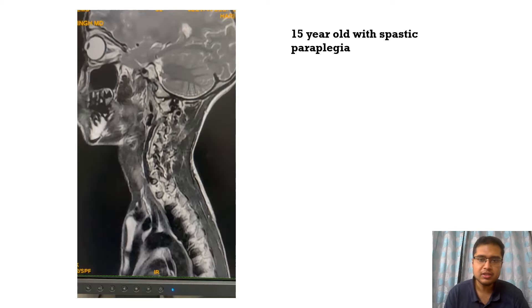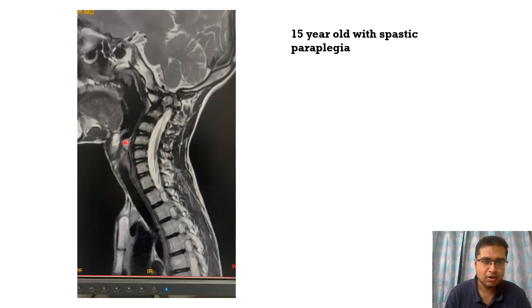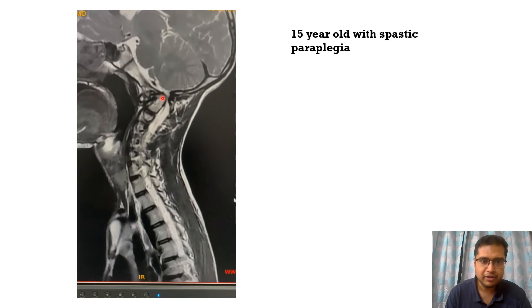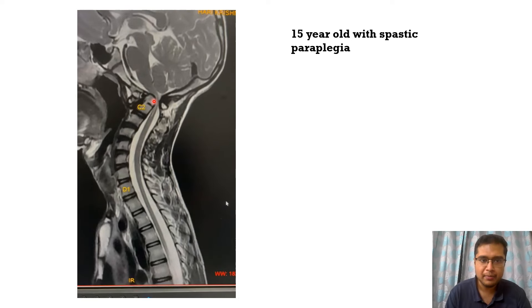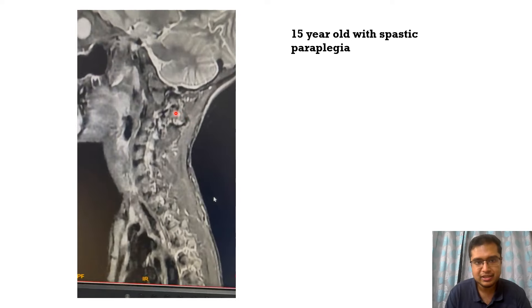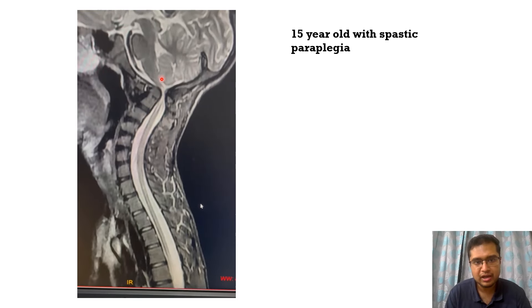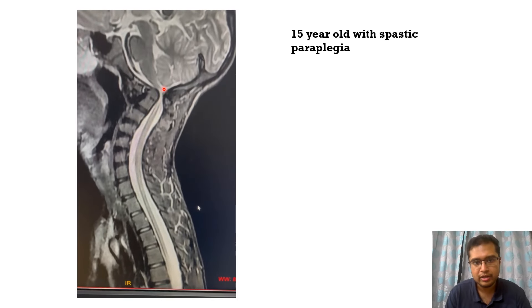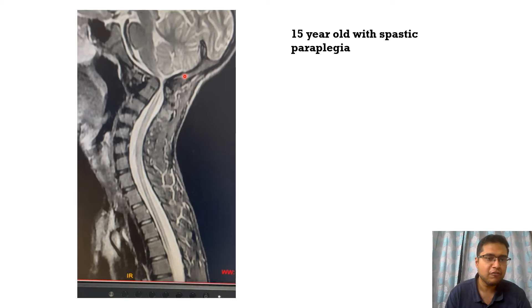Starting with my first case: a 15-year-old boy who came with spastic paraplegia. These are the T2-weighted sagittal images of the cervical spine, where we can see the tip of the odontoid is actually above the foramen magnum, compressing the cord and causing severe narrowing and signal change. There is no tonsillar herniation as such.